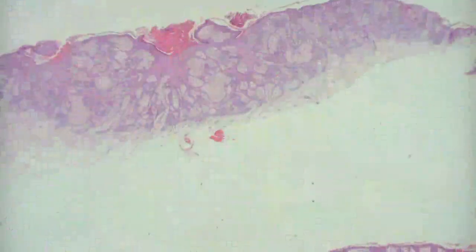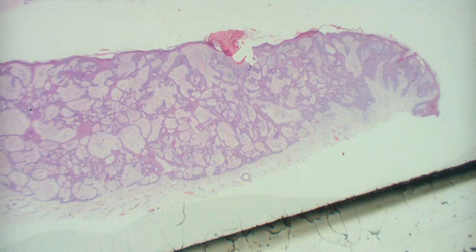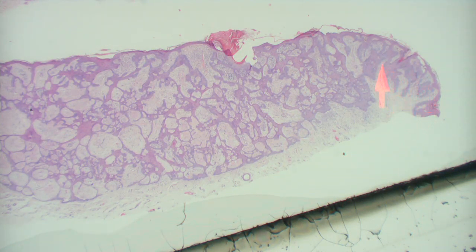So you don't expect to see clefting? Usually not, although sometimes you do. I was looking for that. Yeah, it wasn't here. Sometimes you do see it. Now there's one other item. You're right, TFI is one of the items in the differential. If you just had something like this that was very superficial, you might call it that.